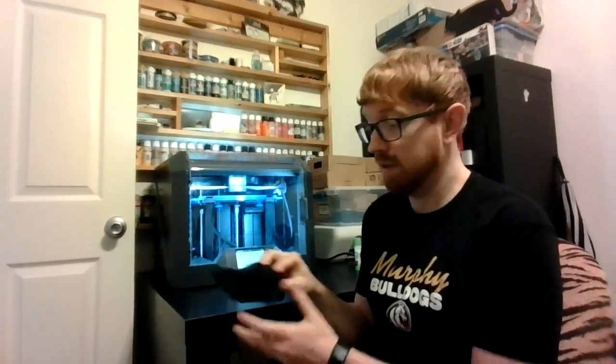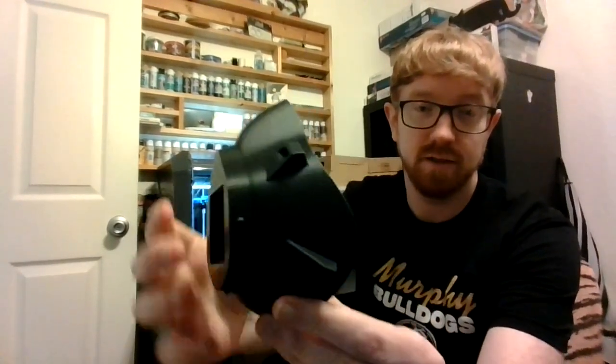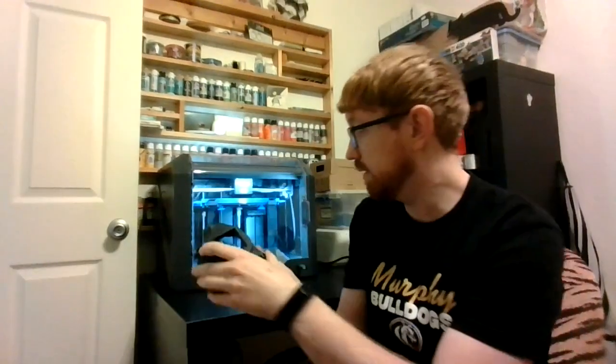Hey guys, Mr. Decker with you again. This is the final update. We've got the main piece of the mask completed. Let me hold this up closer to the camera so you can see it. That was done last night — I showed you on an earlier update.